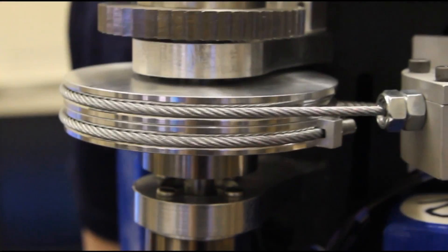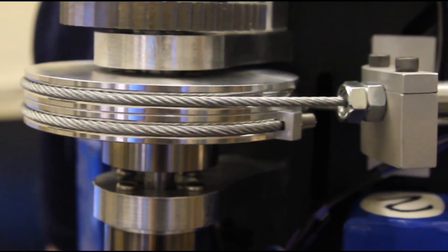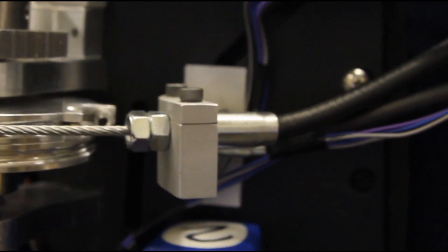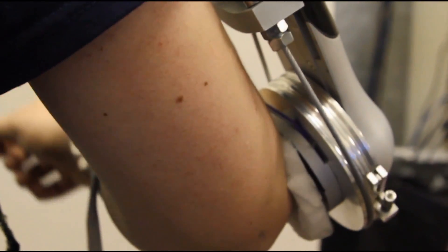The actuation system augments the user's strength. The DC motor located on the user's back is connected to a cable drive which translates motion to the elbow. This works just like the brake cables on a bicycle in that they are flexible but strong.